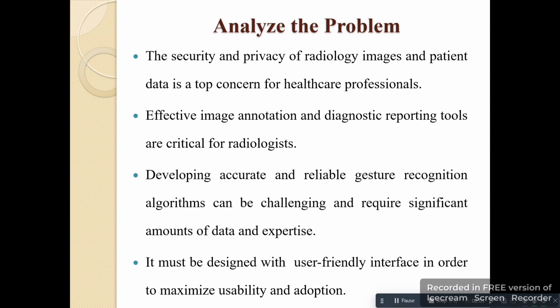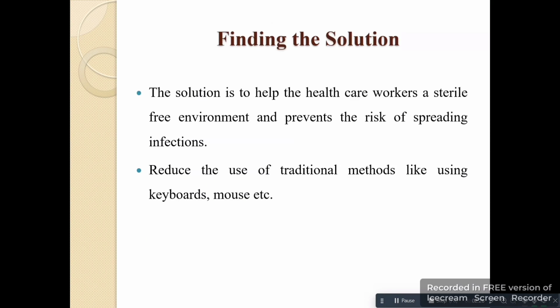Analyze the problem. The security and privacy of radiology images and patient data is a top concern for healthcare professionals. Effective image annotation and diagnostic reporting tools are critical for radiologists. Developing accurate and reliable gesture recognition algorithms can be challenging and require significant amounts of data and expertise. It must be designed with a user-friendly interface in order to maximize usability and adoption.